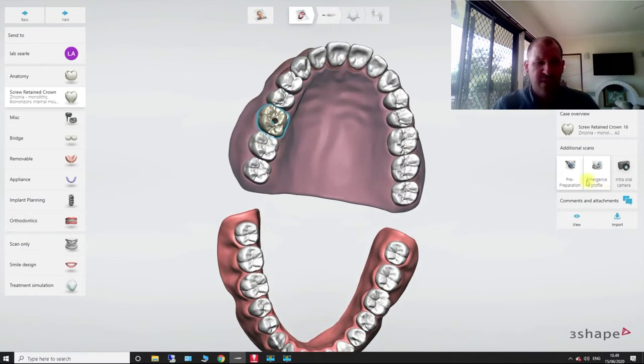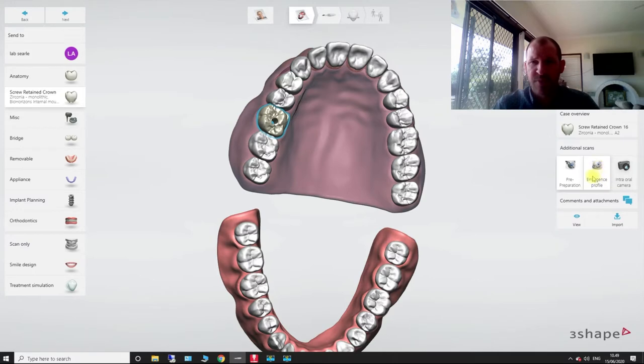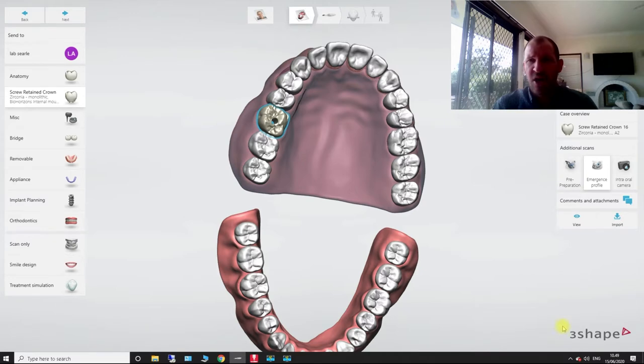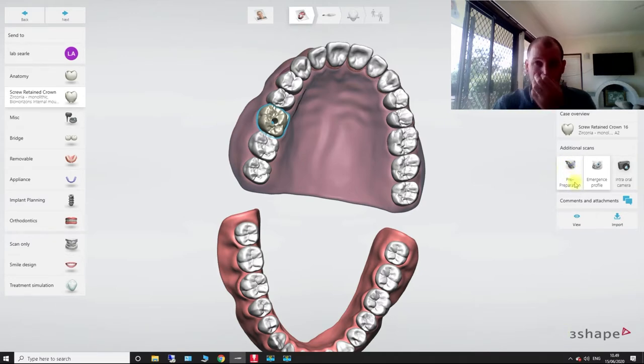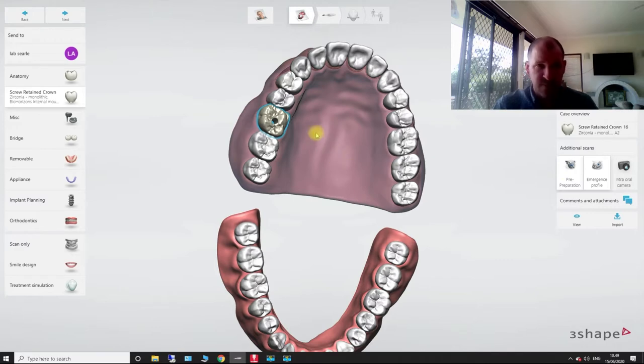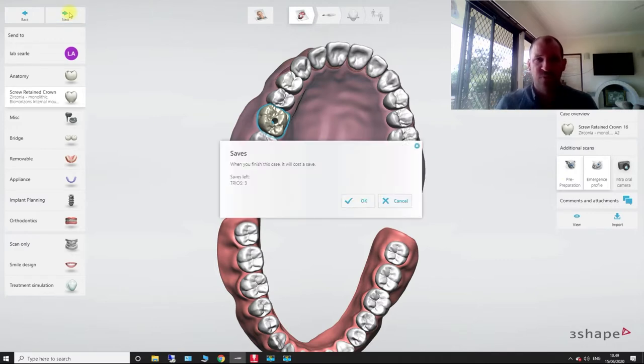So you'll notice over here, over on the right of the screen, see how it's added in our emergence profile scan once we chose the screw retain crown. Now, I always like to do my pre-preparation scan beforehand.